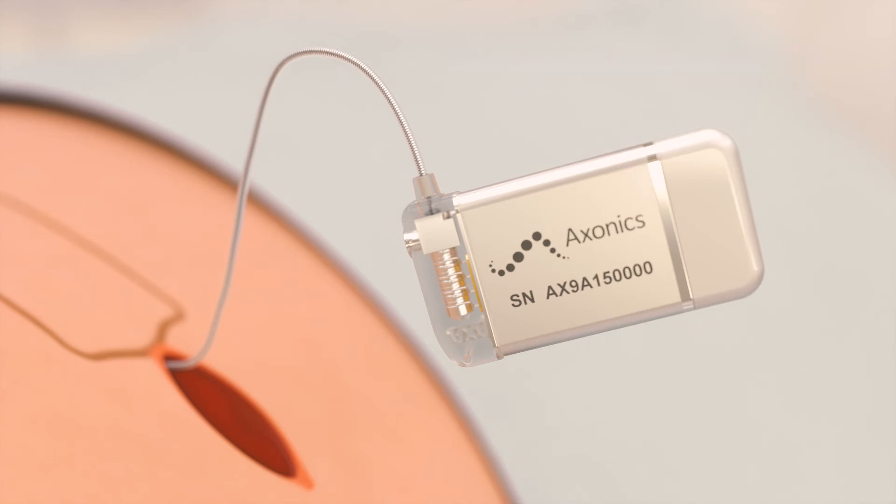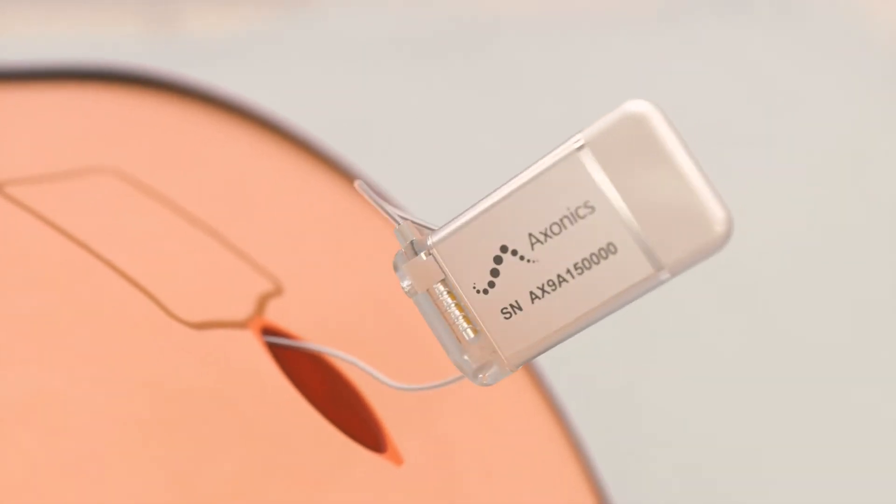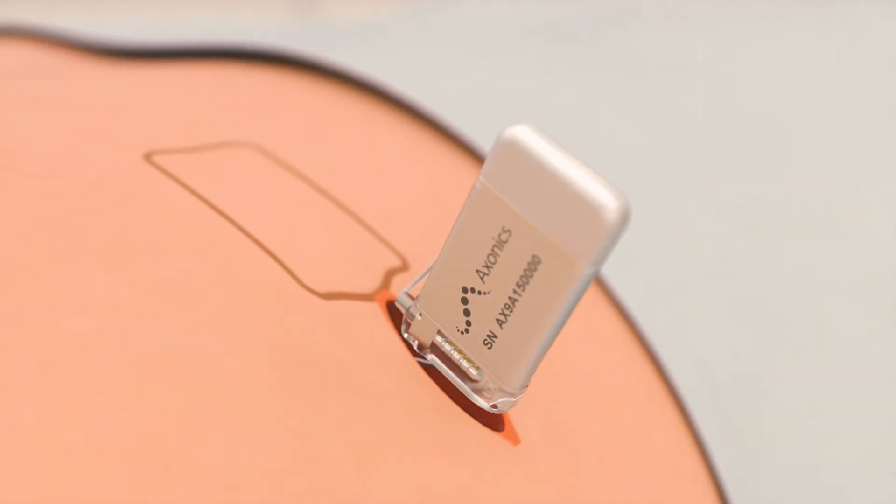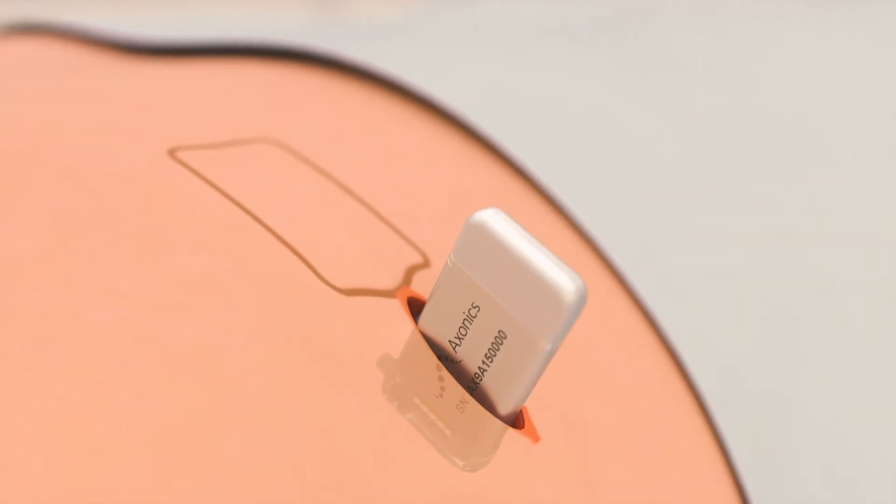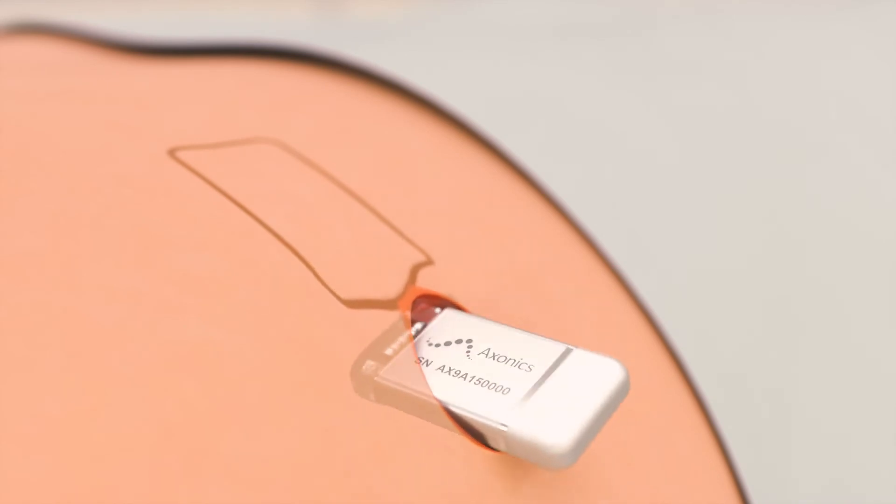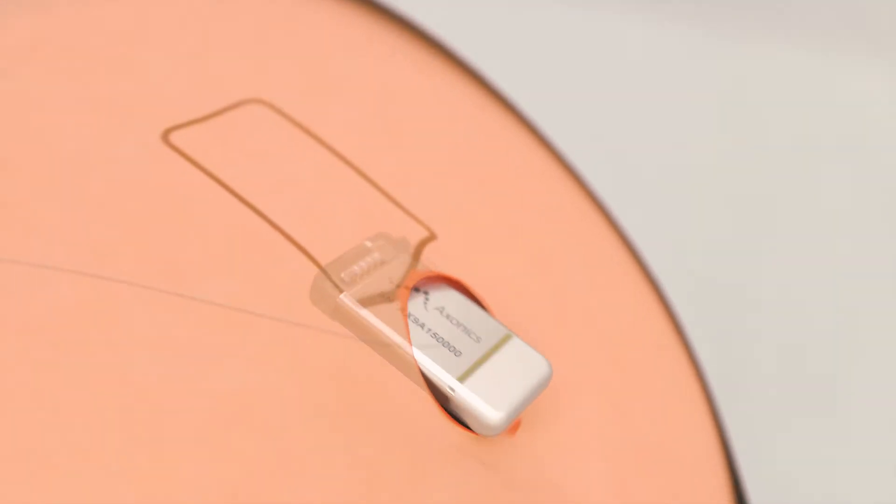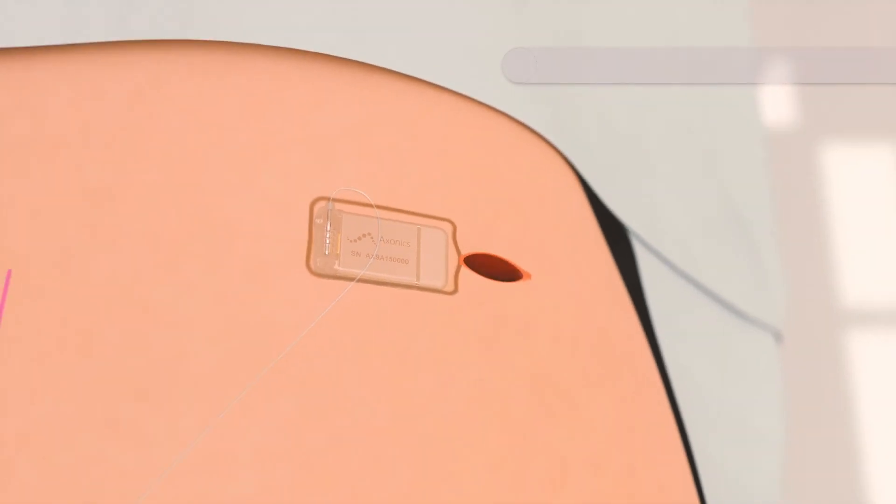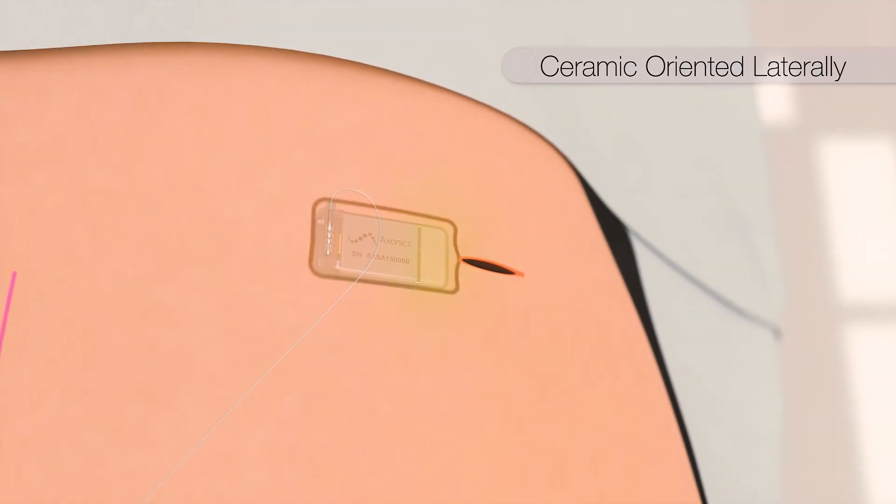Excess lead is coiled and placed behind the stimulator which is inserted into the pocket ensuring that it is flat and level to the skin. The ceramic window of the stimulator should be lateral and the lead connection should come from above.